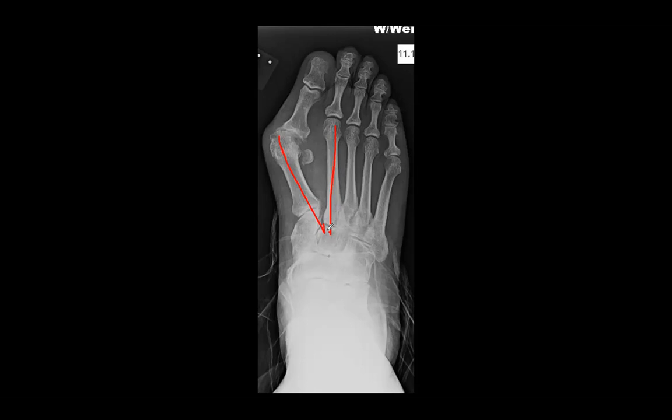We talk about over 12 being pathologic, but at the same time, if somebody has an IM angle of 8 and they have a painful bunion, then we know that we may do Lapidus, because it's an insufficient first ray that may be leading to that. So it's more of a clinical evaluation combined with x-rays. But we think smaller, we're going to go distal. Larger IM angles, we're going to go more proximal. But again, that can be antiquated as far as how we think of it, because you're going to meet some people who just do a Lapidus for everybody, because we know that you get a good correction there and you get some stability of the first ray.